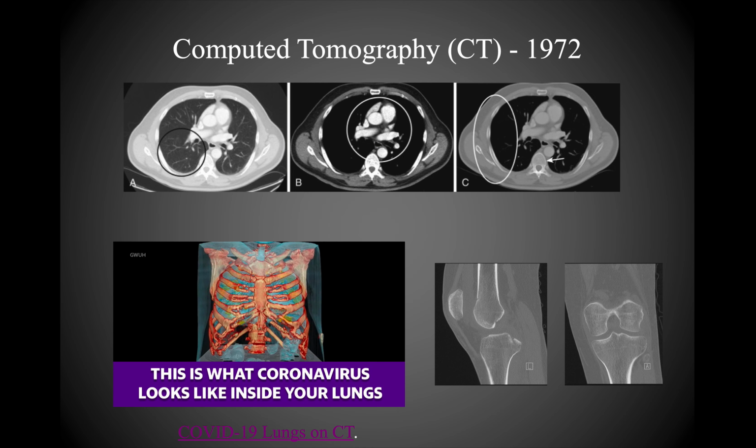This is a huge advantage because instead of having a 2D projection of 3D structures, you now get a full three-dimensional view of the body where structures aren't overlapping on each other. You're looking at progressive slices of the body, which makes it much, much easier to appreciate the anatomy and, frankly, pathology and injury that might occur throughout the body.